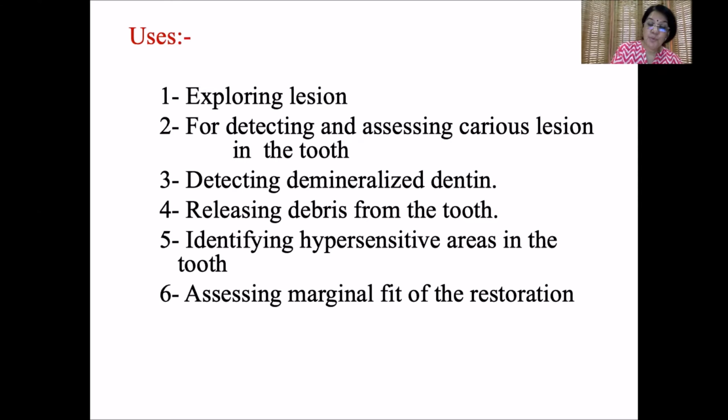So if you move your finger from the surface of the laptop to the trackpad, you will find that there is a slight edge there, isn't it? If on a restoration, when you're moving a probe, you feel this edge, that means there is a defect. And that defect is the weakest part on your restoration, and your restoration is going to fail.